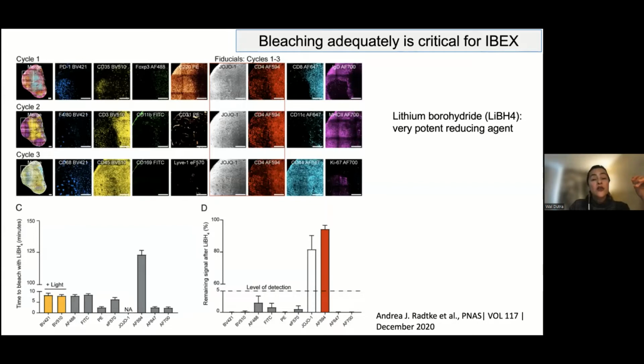because you're going to use these different markers as your guides, when you go overlap the different cycles, to guide where you were in the tissue, to be sure that you are overlapping the different cycles in the very same place. So this is absolutely critical. It's very important that you maintain these fiducial markers here.